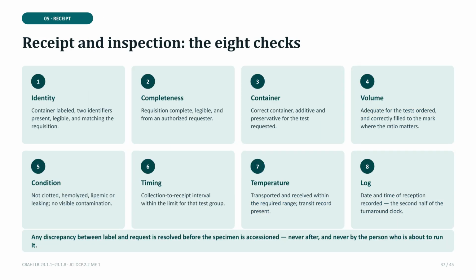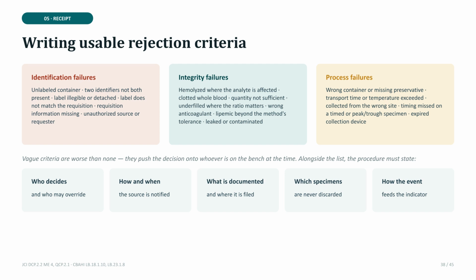Chapter 5 focuses on transport and accessioning. This is where you monitor the transit time, temperature, and physical route of the specimen. Without a transit record, any defined stability limits remain merely aspirational. Consider the reality of your samples.